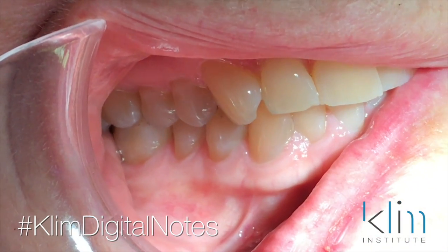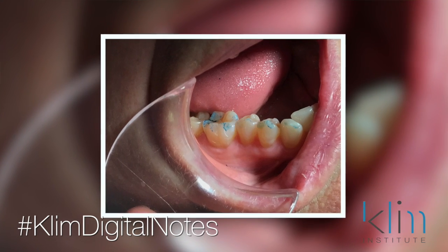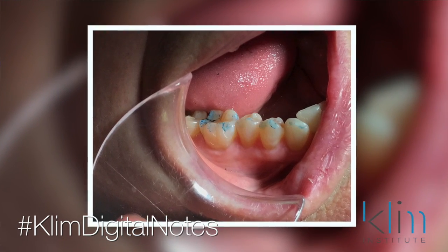Further analysis documented that there's no sensitivity to hot and cold, normal occlusion, no pain — so in other words, she bites in CO and there's no pain. Assessing the occlusal contact with bite paper showed a plunging cusp. In this case, we thought that maybe there was either a cracked tooth or there could be hyperocclusion. My thinking is more hyperocclusion because of the way the plunging cusp is appearing, so we went ahead and adjusted.